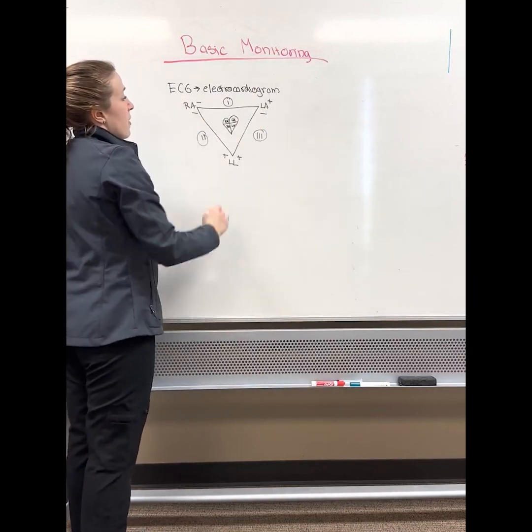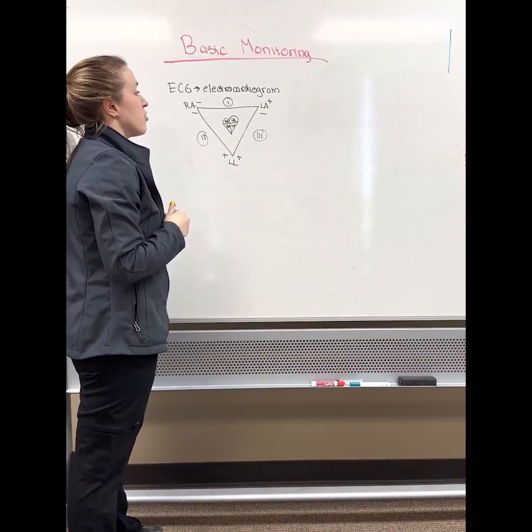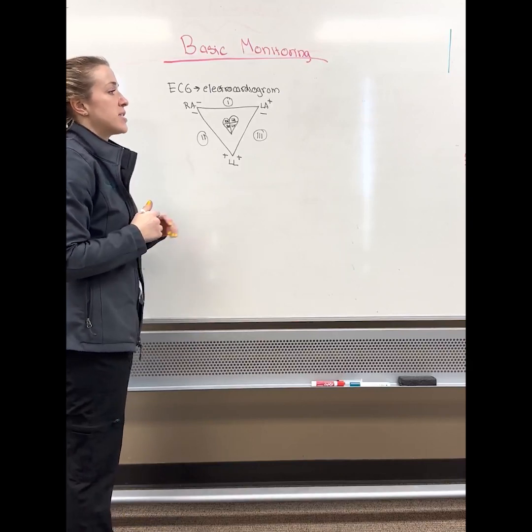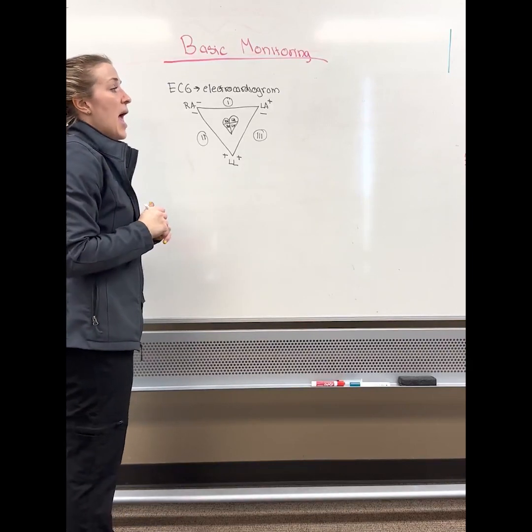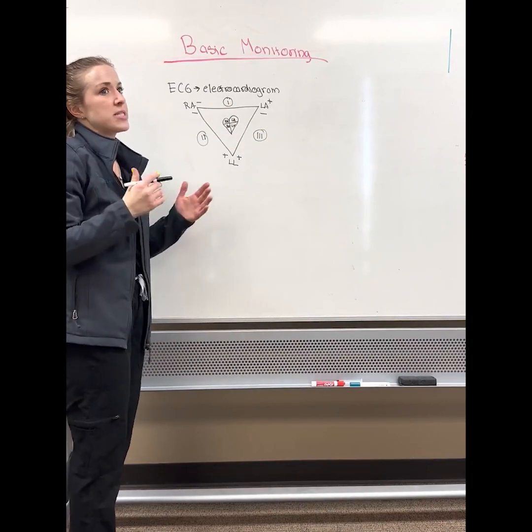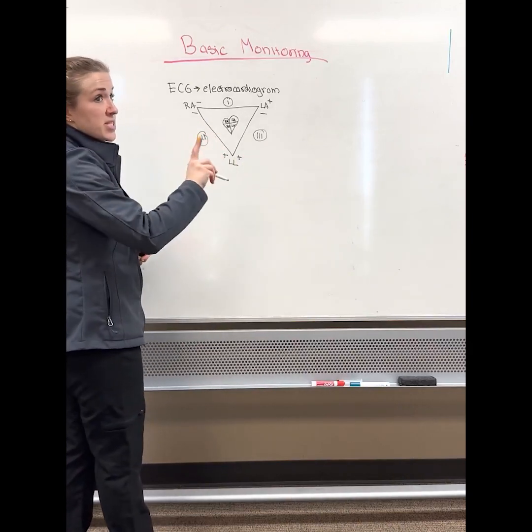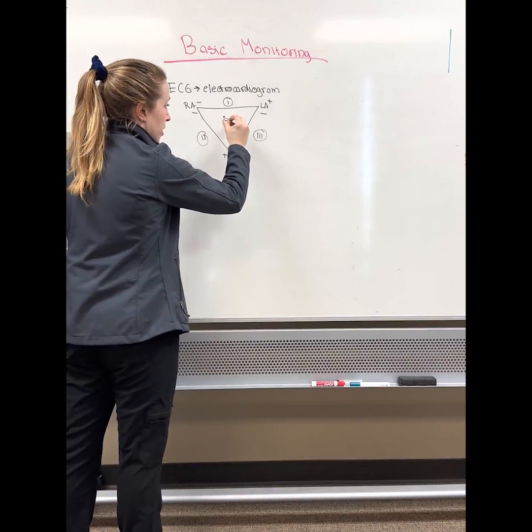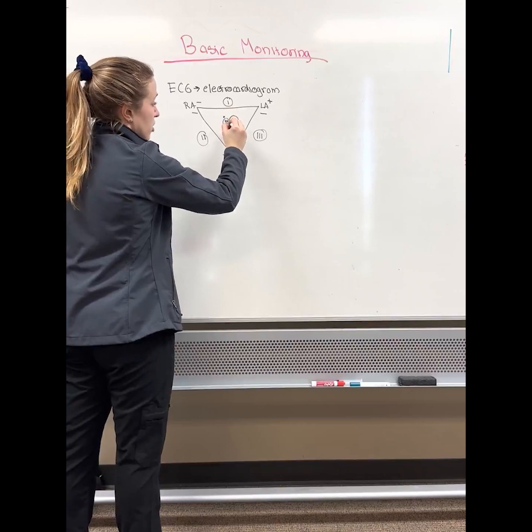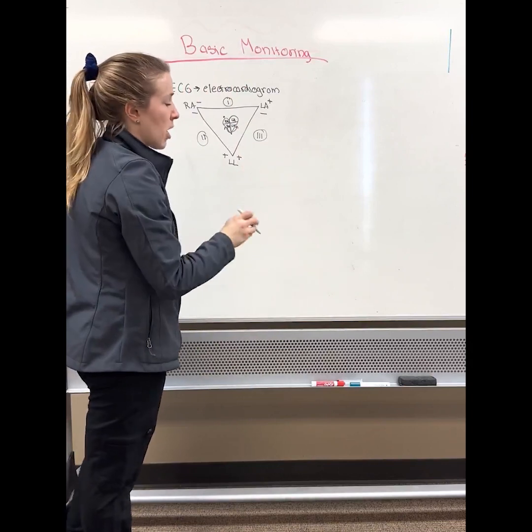So the ECG tells us about the electrical axis of the heart. Basically how that works is through what is known as Einthoven's triangle. What Einthoven's triangle does is put 3 different measurement points on the body, and depending on what direction you're reading the electrical activity of the heart, you're going to get a different snapshot of the electrical activity. We know that the heart depolarizes, or sends its electrical activity, from top to bottom, right? It goes from the right atrium down the middle of the 2 atria, down the ventricles, and kind of up the side. You probably remember this from recover CPR. So from top to bottom.